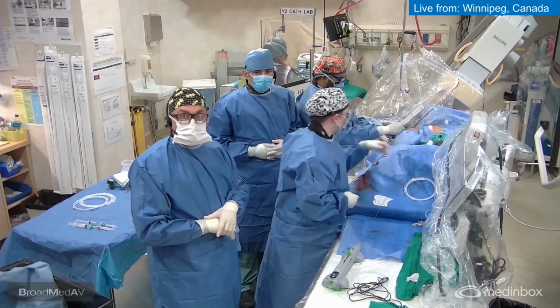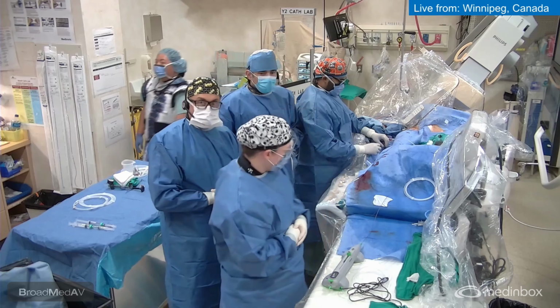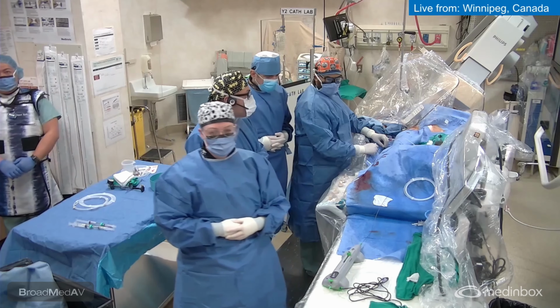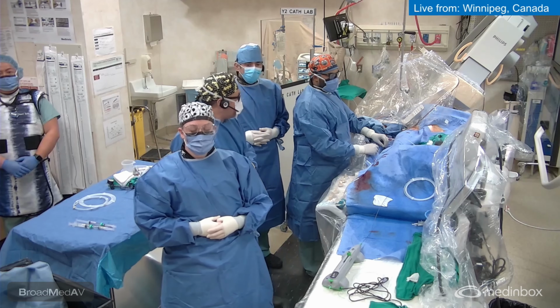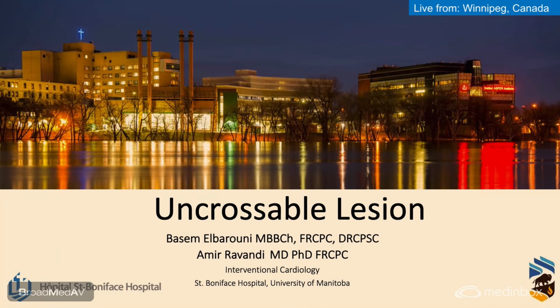We have an interesting case for you planned. We're here from St. Boniface Hospital, Winnipeg, and with me today, Dr. Bruni, Dr. Arjun Gupta, Chelsea, our team, Leonard. We're going to start with our presentation, and I'm going to ask Dr. Minhas to go with the presentation.